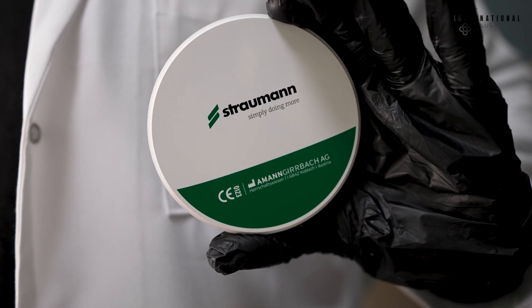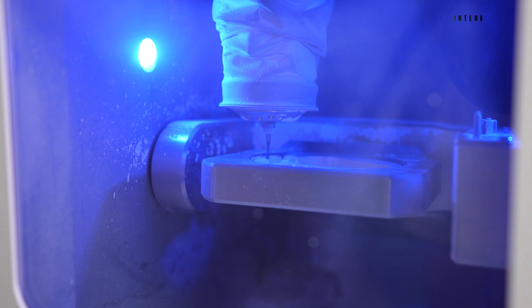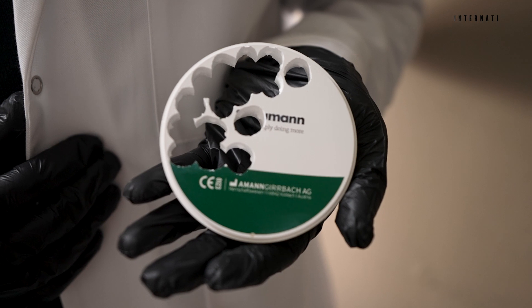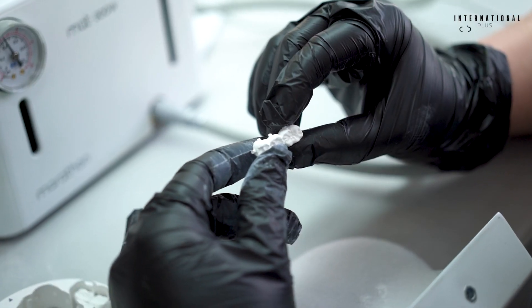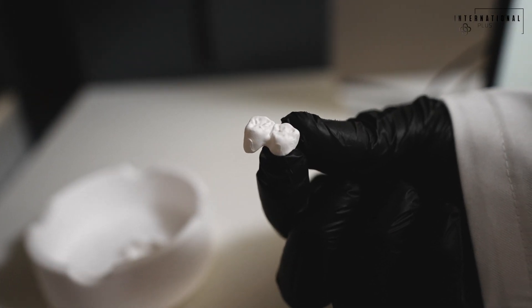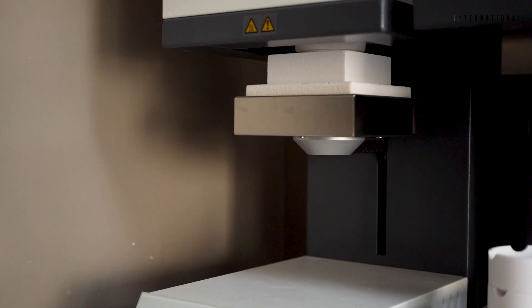The teeth are scraped from the zircon block over about 6 to 8 hours, then baked in the sintering oven for 8 to 10 hours, and it emerges with the main lines.